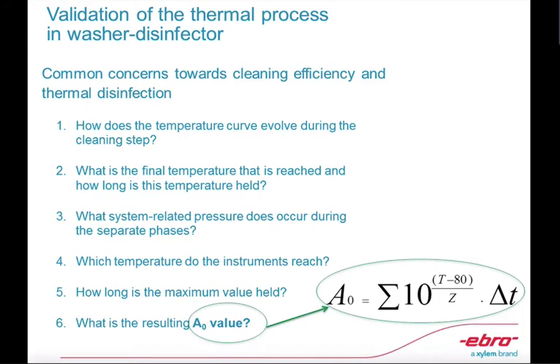Then you need data loggers with temperature sensors. Second, what is the final temperature that is reached and how long is this temperature held? So now you need a temperature sensor with a recorder and an accurate time. Third, what pressure occurs during the separate phases?